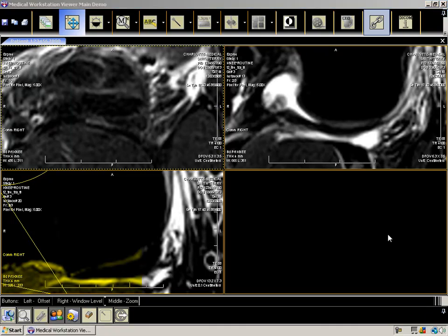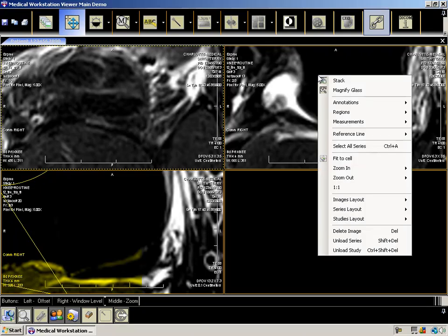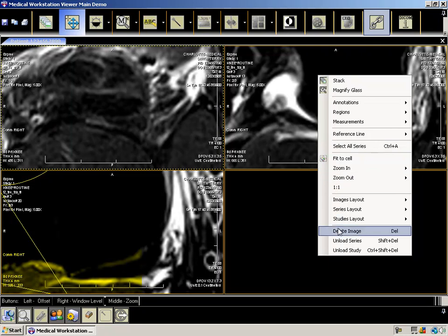If you right-click on a sub-cell, a context menu will appear containing the most frequently used functionality from the toolbar. However, there are four extra features on the context menu that are not on the toolbar: the ability to select the entire series, delete an image, unload a series, or unload a study.